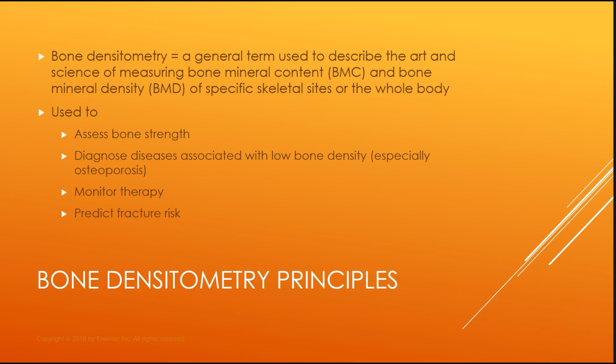Bone densitometry is a term used to describe the art and science of measuring the bone mineral content, abbreviated BMC, which is used in a lot of the formulas for DEXA, and bone mineral density, BMD, of specific skeletal sites or the whole body.